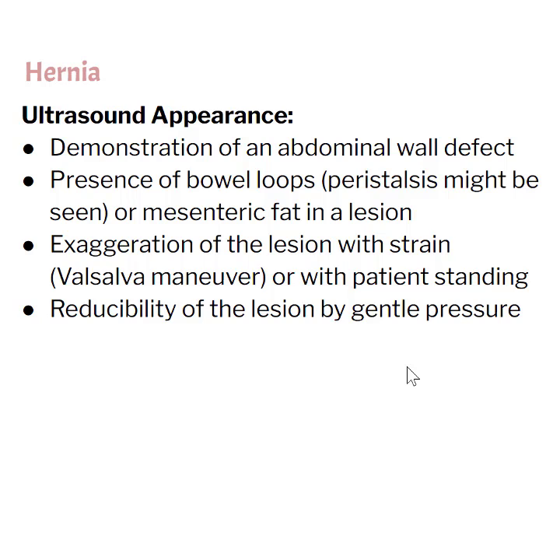The other thing that you may need to do to exaggerate the lesion is to have the patient stand. This is most likely going to be done with more inguinal hernias. And so you have the patient stand up. That causes the bowel to become dependent, falls towards the pelvic floor, which then also causes it to herniate a little bit more obviously through the inguinal opening.